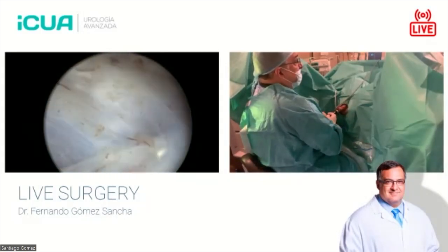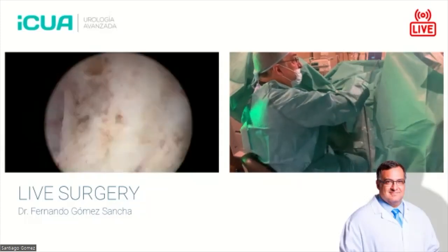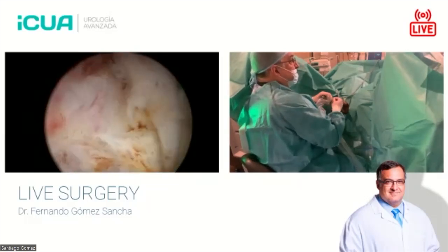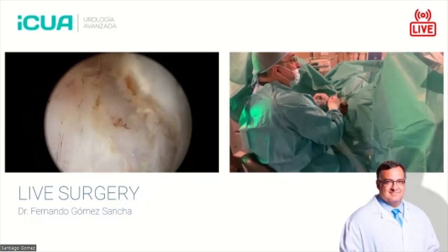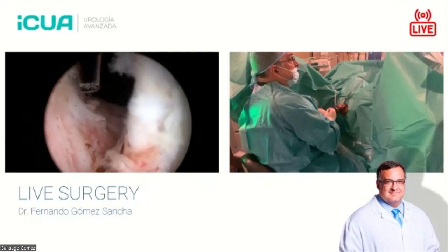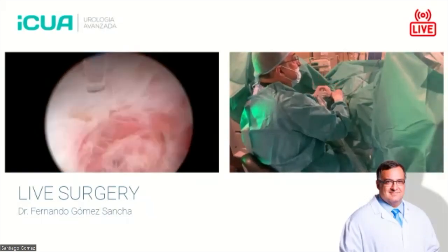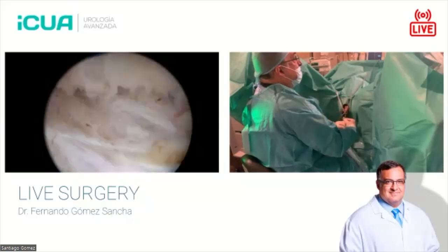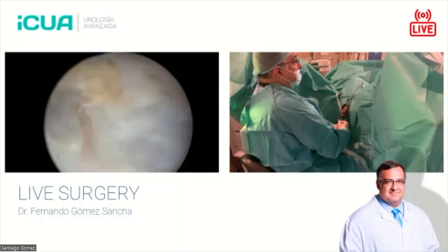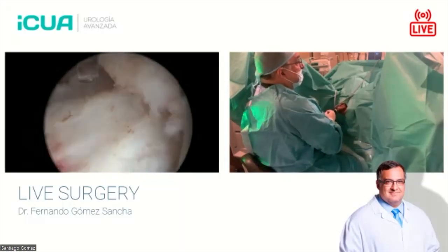When you open the connection to the bladder, of course, if there is some bleeding, you know, the blood will enter the bladder and then it will be more difficult to wash the bleeding. So here, I'm trying to find out how this curve is taking place, coming from the posterior plane towards the bladder neck in this region. So here we will make small improvements, a small dissection, you know, you have to win the little battles if you want to win the war.